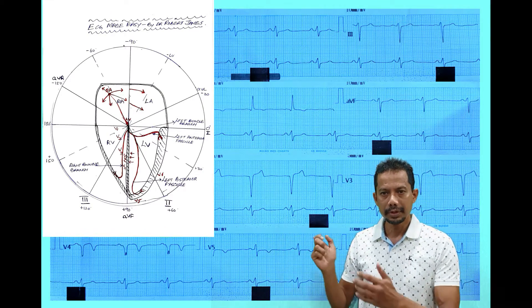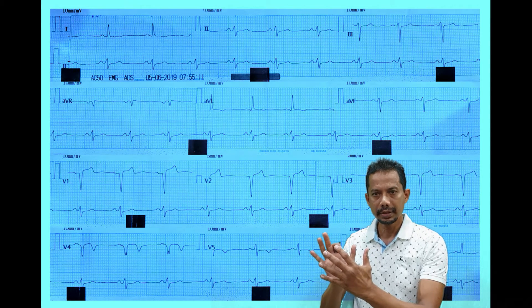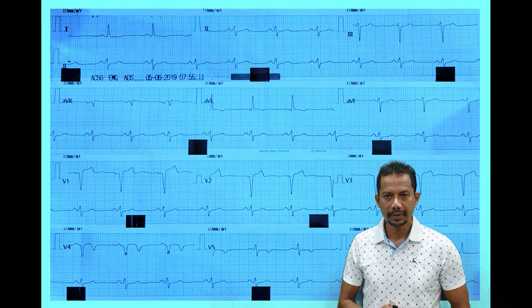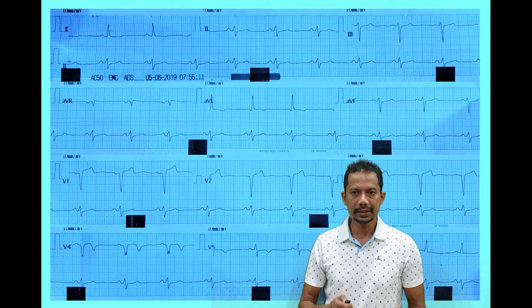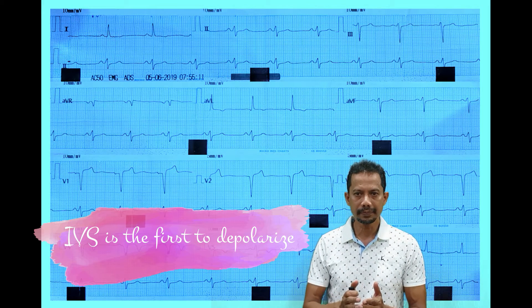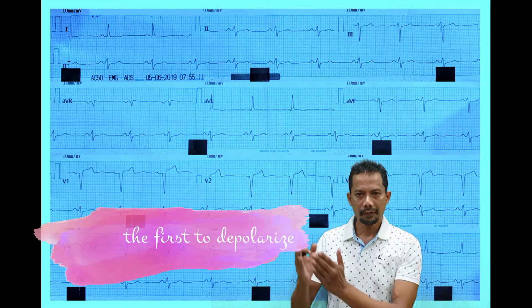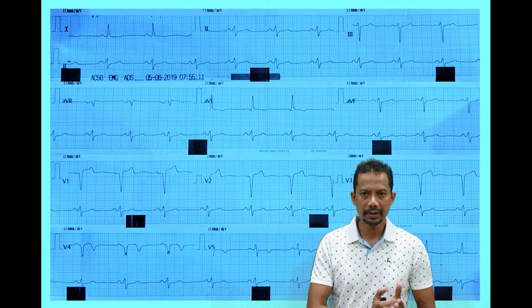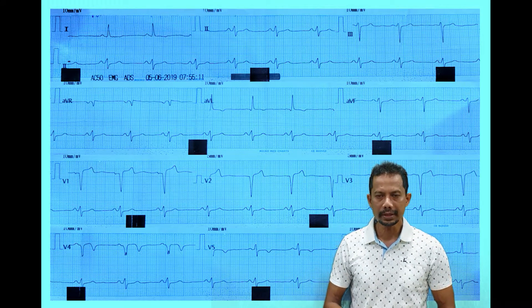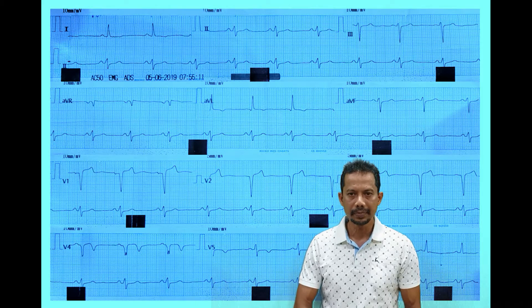V1 and V2 perceive the impulse coming towards them when the interventricular septum is getting depolarized. In previous ECGs we discussed that the interventricular septum is the first part of the myocardium that is depolarized from left to right by the left bundle branch. Some books say it is a septal fascicle that depolarizes the IVS.